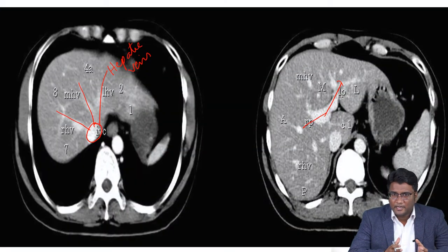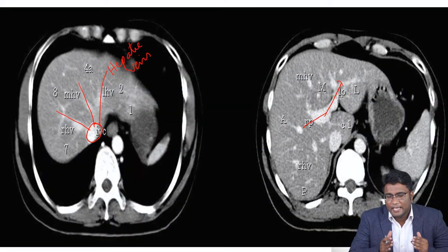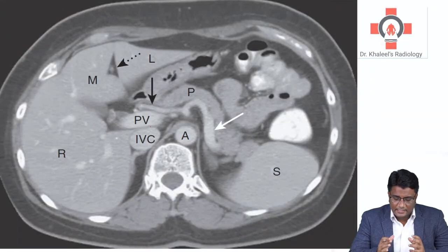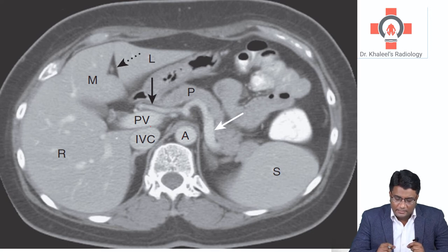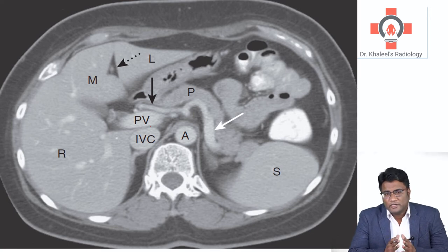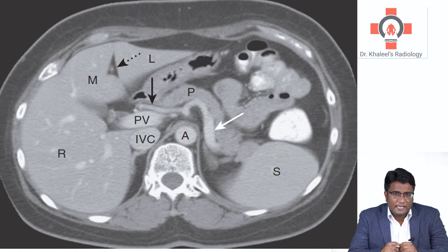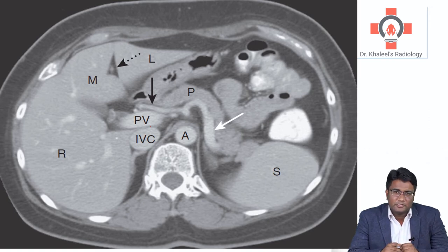You should know how to identify the hepatic veins: they run longitudinally in the liver and converge towards the inferior vena cava. The portal vein goes transversely in the liver, and the hepatic artery is present just anterior to the portal vein. Regarding enhancement pattern: when the aorta is enhancing, the hepatic arteries will be enhancing, and in the portal venous phase the portal structures will be seen better.